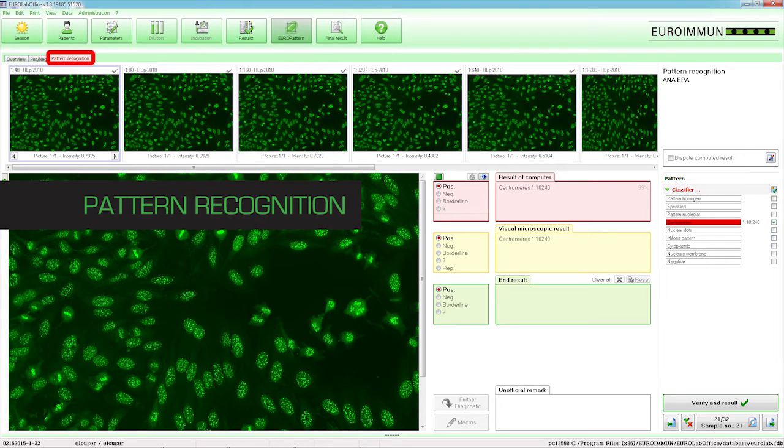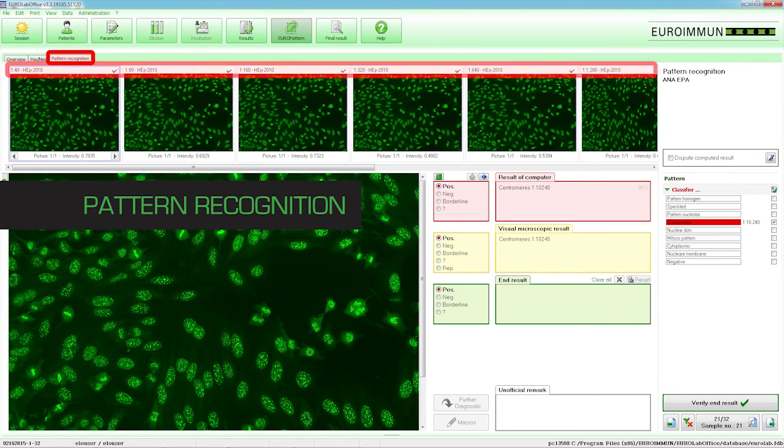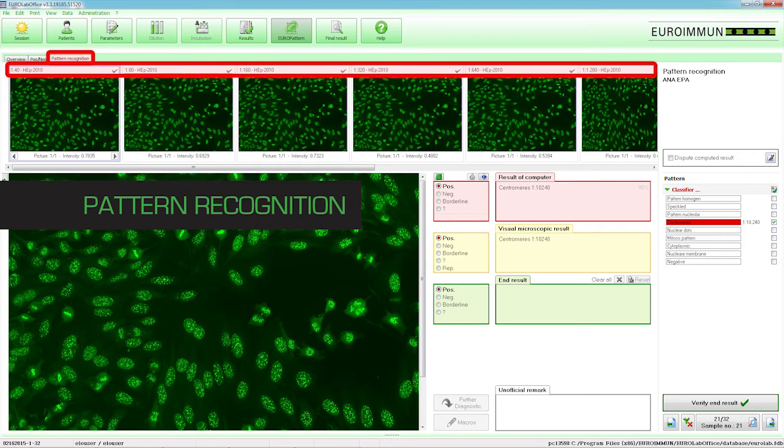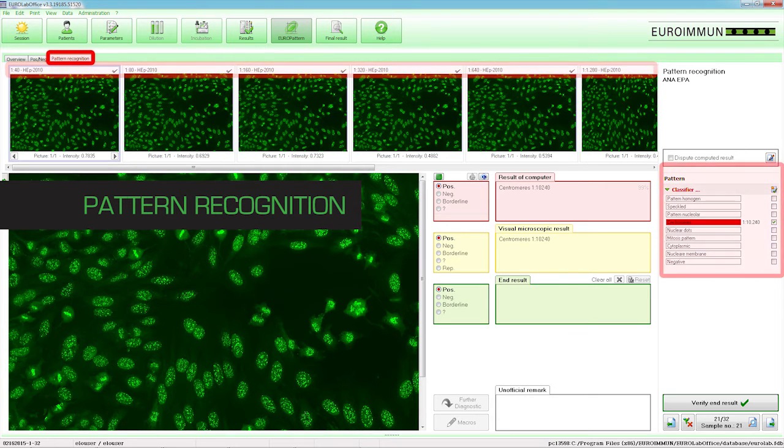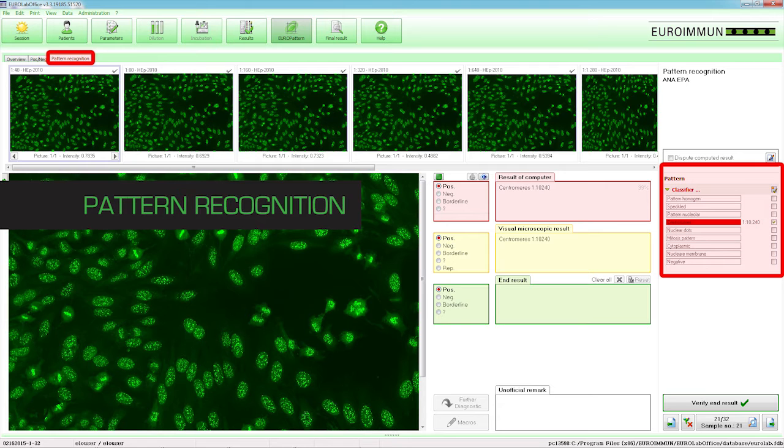Under Pattern Recognition, information about the substrate, dilution and number of available images is located above each image. All results and titers per patient are displayed on the screen at the same time. Information regarding the fluorescence patterns can be found to the right of the magnified view.